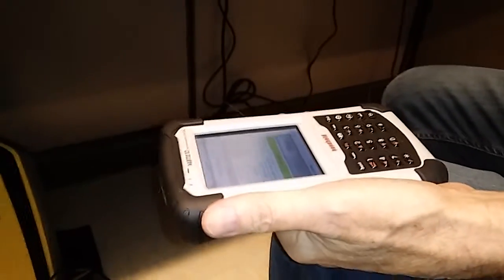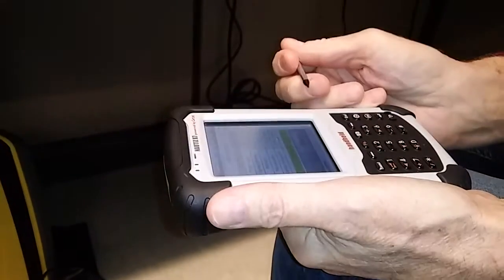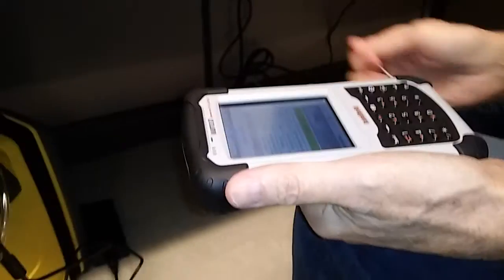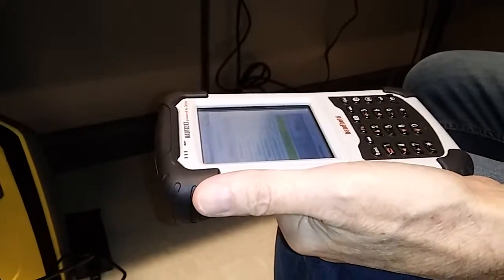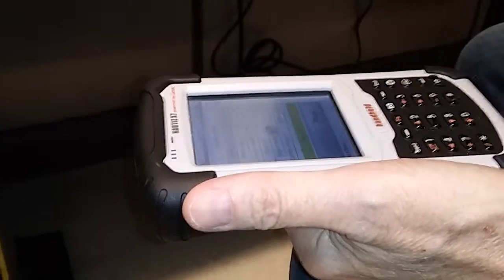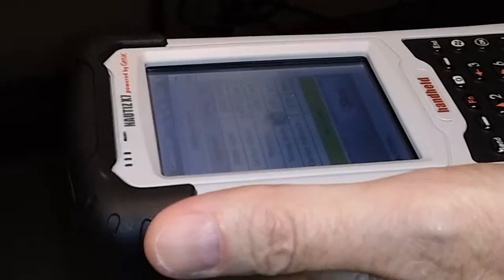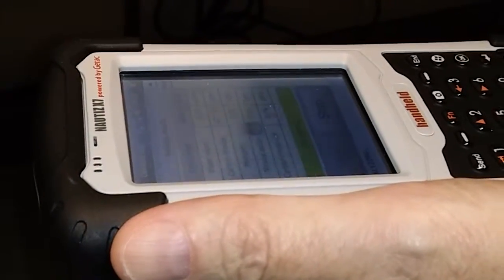Carbon monoxide is 0.7. And again, that's assuming that we have zero there. So the nitrous went down to 0.01. But your carbon dioxide is minus 477. Let's see the next one. Looks like our carbon dioxide is going to be off by about 400.